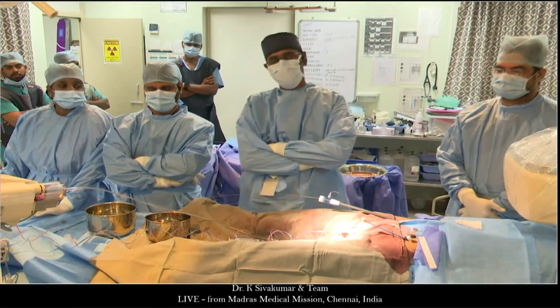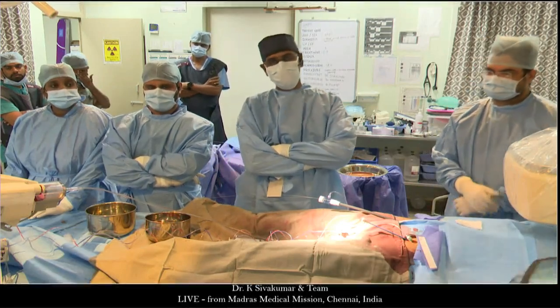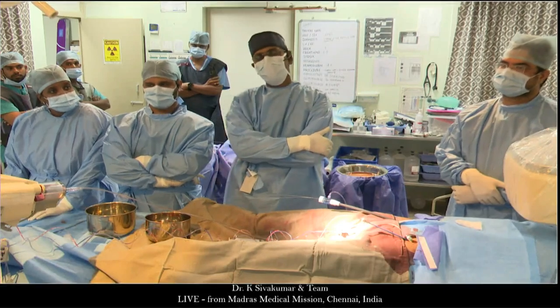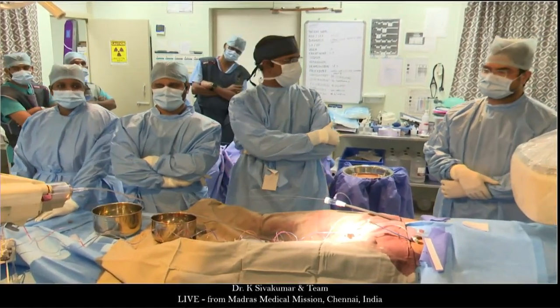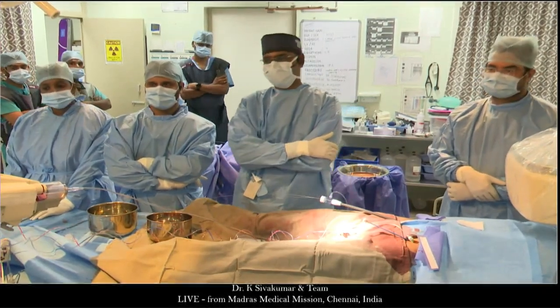Thank you very much. So thanks once again for the opportunity to transmit our second patient. Here with me, I have my colleagues, Dr. Avanish and Dr. Pramod Sagar. My scrub nurse is Kirtana, and our imaging expert is Dr. Tejasvi, and Dr. Giridhar is taking care of the intubation part. The patient is on general anesthesia.